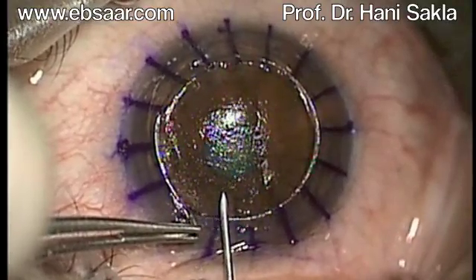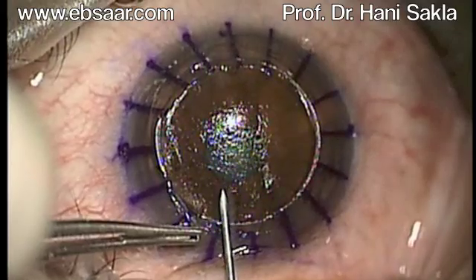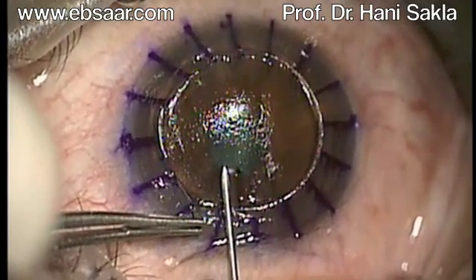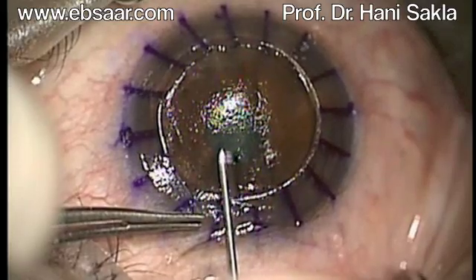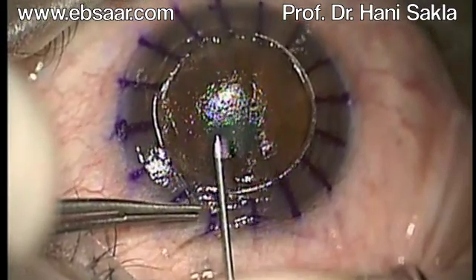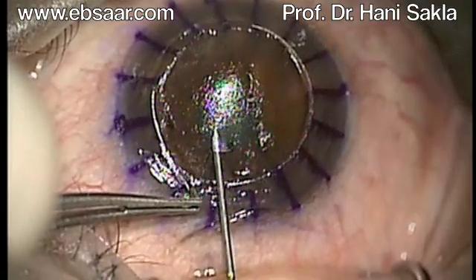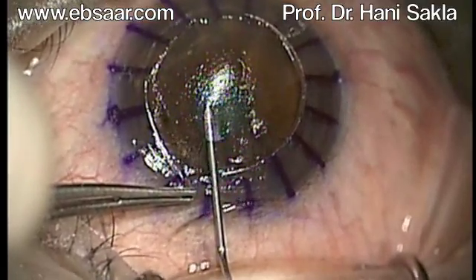Initiate careful entry into the stromal bed at the 12 o'clock position with a sharp 27G needle. Entry should be near parallel to the stromal bed, at 2 to 4 mm from the corneal center. The depth should be approximately half of the stromal bed.